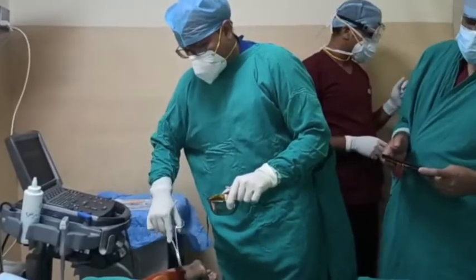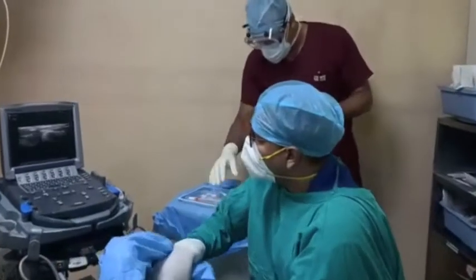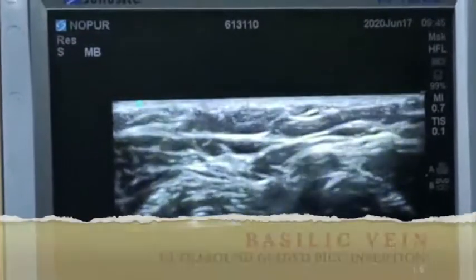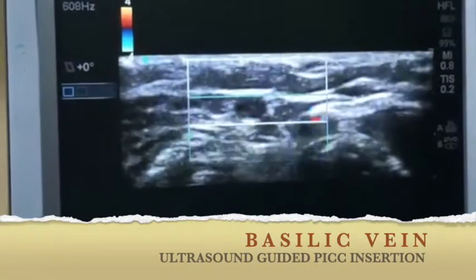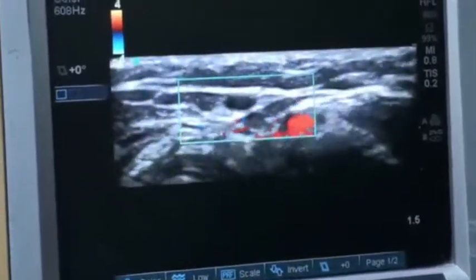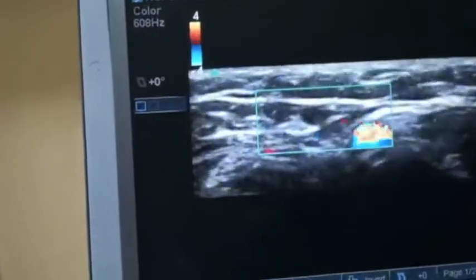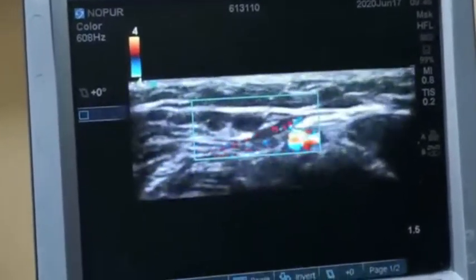We will prepare the site for PICC line insertion. Under ultrasound guidance, we will identify the basilic vein. You can see the basilic vein in the box. It is compressible, as compared to the artery which is relatively non-compressible and pulsating.